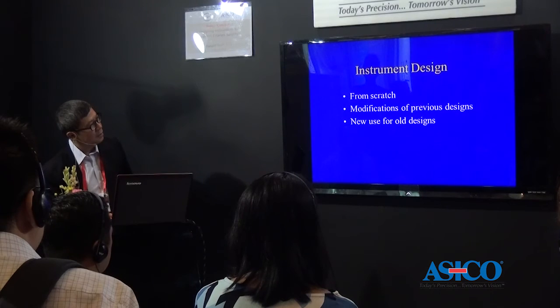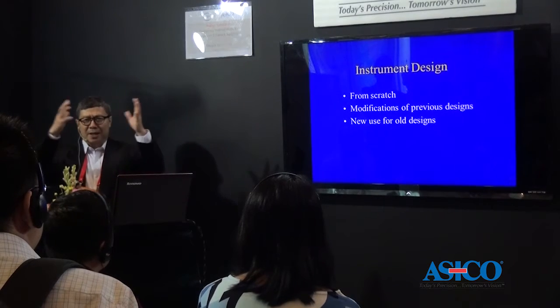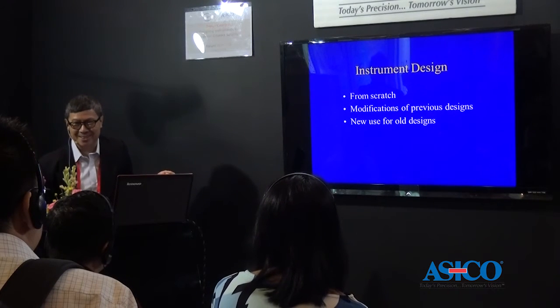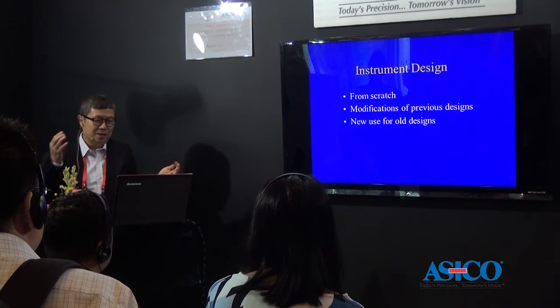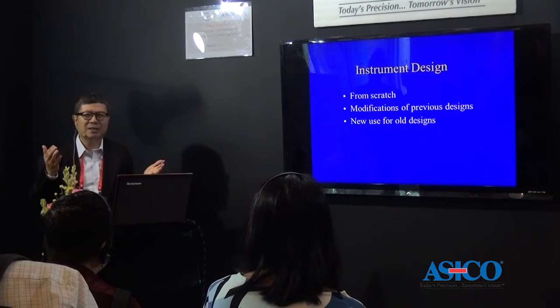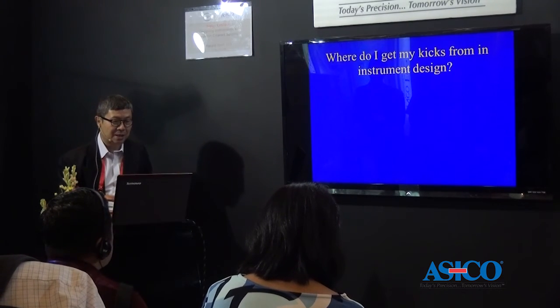So I'm just going to sum up this very brief talk on instrument design by saying, of course you can sometimes have a brilliant idea and design a totally new instrument that nobody else has ever thought about. But that's not so easy. Because cataract surgery has been around for 30 years. It's much easier if you modify a previous design. Somebody else has an instrument and you find, hey, it's not as good as I'd like it to be. You have an idea, change it. Or you have a new use for some old designs.